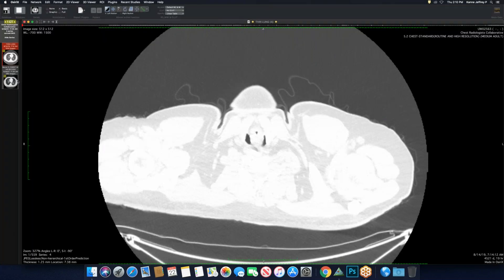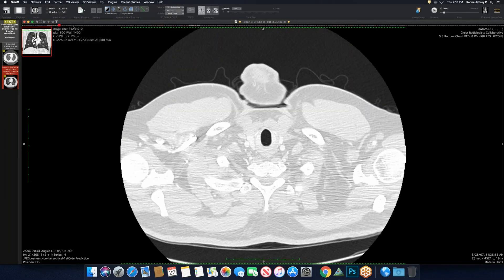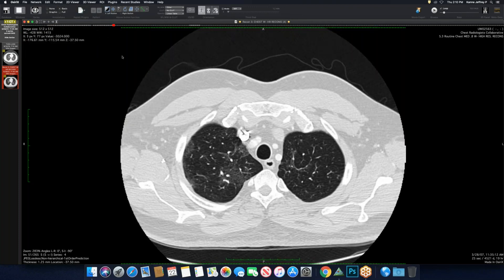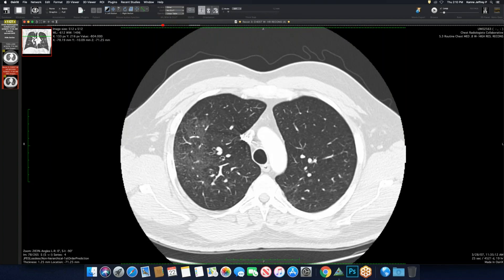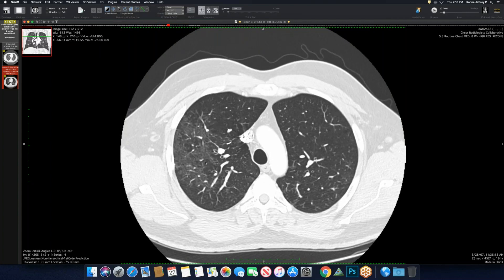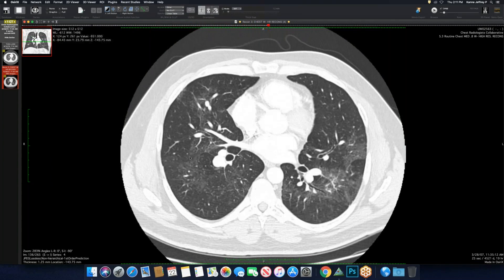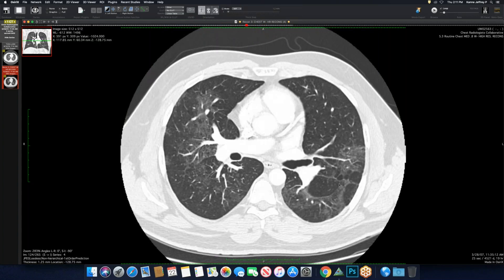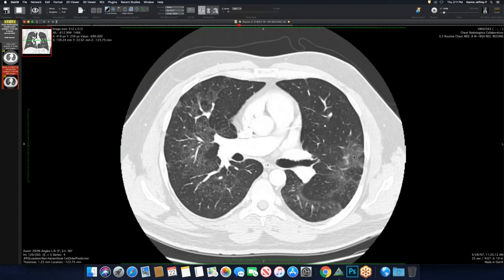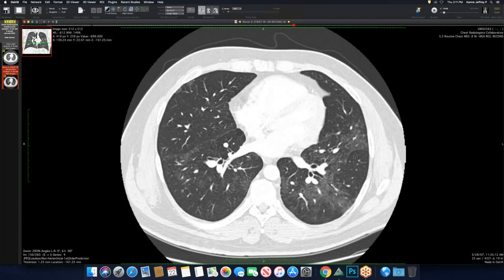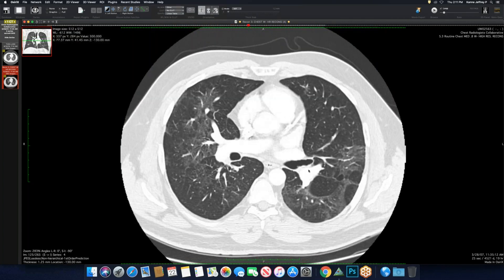This is a neat case — something I don't see very often. This is a patient with sarcoid. This is their scan at presentation. It has a so-called ground glass component, but if you look carefully, it's actually tiny little ground glass nodules clustering together that give this appearance. Back in the days of five to seven millimeter thick CTs, this was called ground glass opacity. He has a little bit of dilated airways going through some of these areas, and there is more confluent ground glass in some of it. A good peribronchovascular distribution for sarcoid, fairly symmetric, no large lymph nodes.